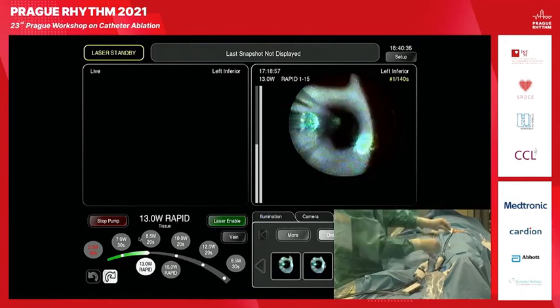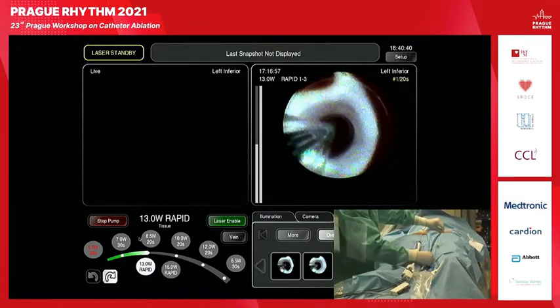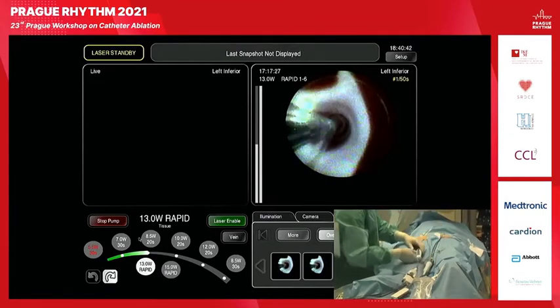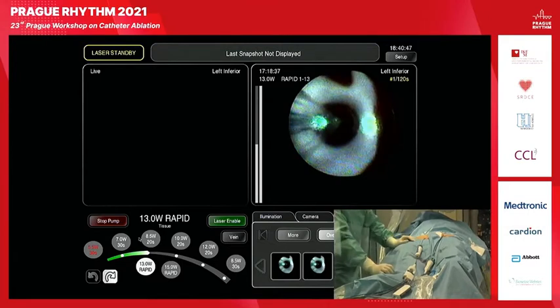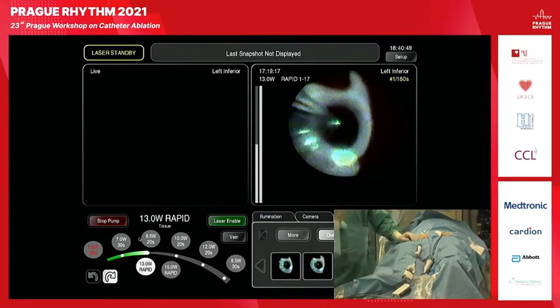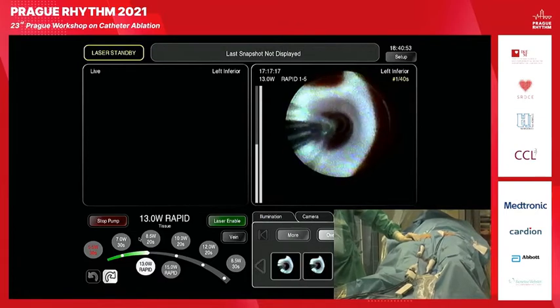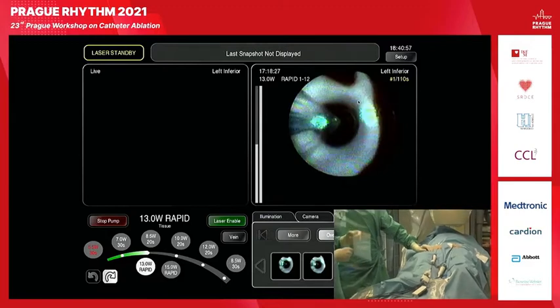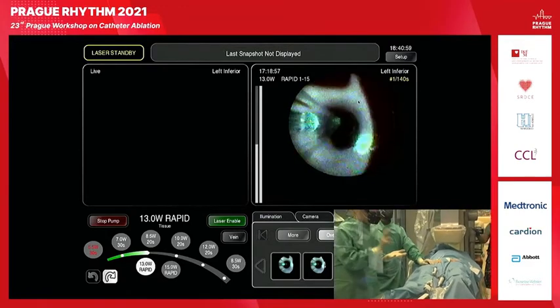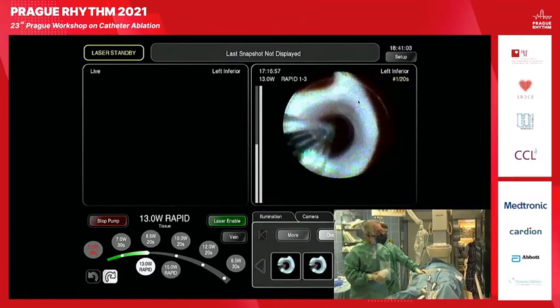So this is a very nice vision of the left inferior vein, and you can clearly see how big an amount of contact you can get with that kind of balloon. And actually the laser beam is placed specifically on the side of a really nice amount of tissue. So any charring, any other stuff, or floating blood could be excluded.